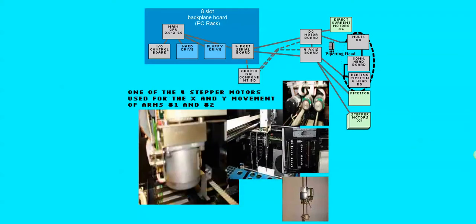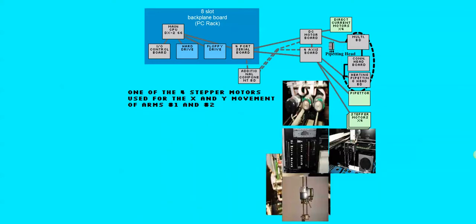The pipetting head is equipped with the 3 needles. The movements for the X and the Y are completed by means of belts and a return pulley. The suction head, which I'm referring to as arm 2, movement is made by a Y belt and a return pulley. All of the Z movements, the up and down, are controlled by the DC motor control board.